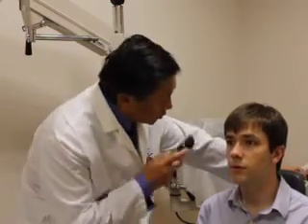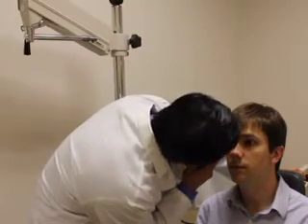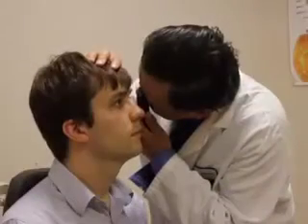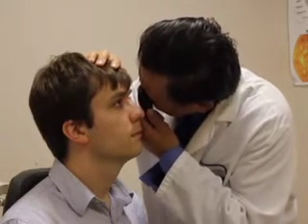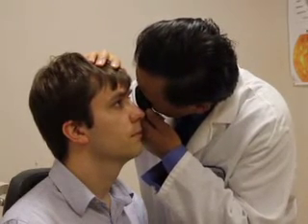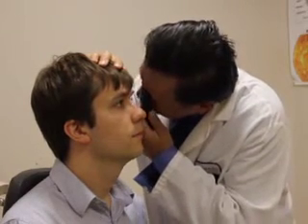Switch on the ophthalmoscope light and begin with the 0 diopter lens. You may use your contralateral hand to elevate the patient's upper eyelid. Always use your right eye to examine the patient's right eye, and your left eye to examine the patient's left eye, to avoid being nose to nose with the patient.